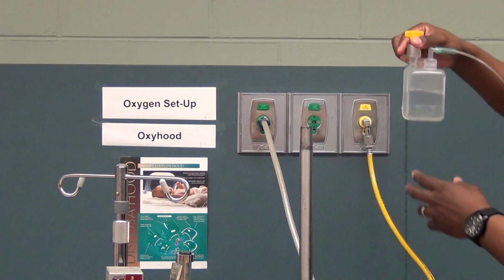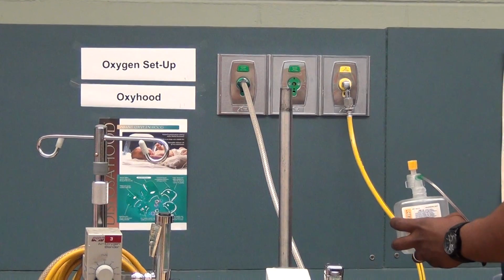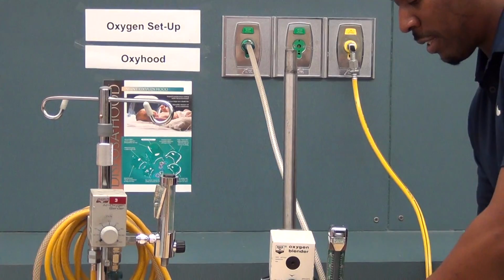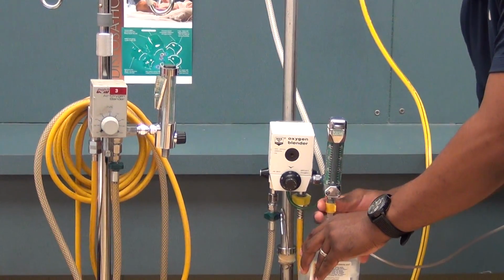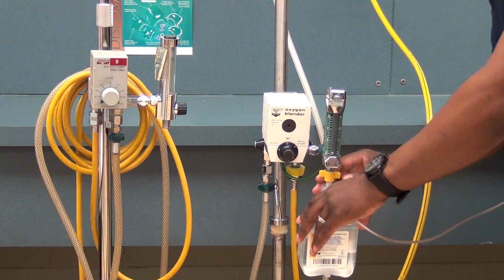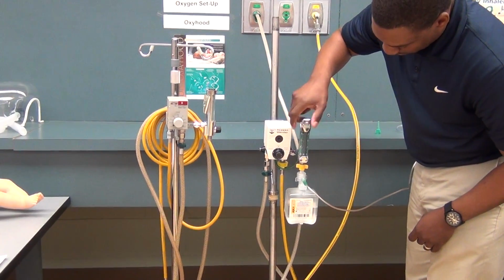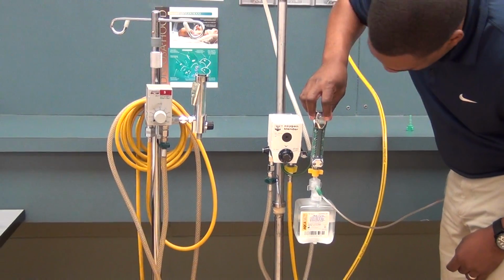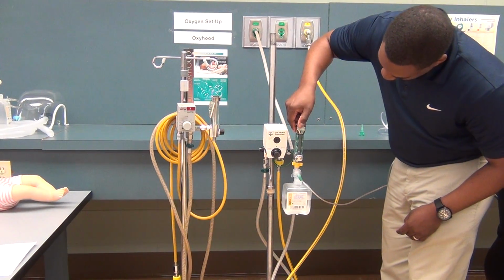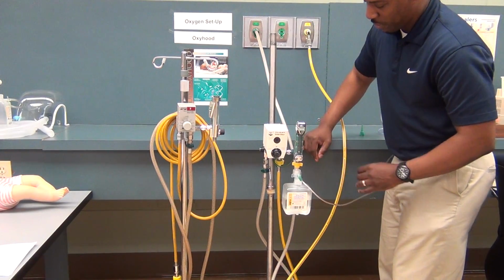In order to use your blender, you can still attach a water bottle if necessary, or your Christmas tree attachment if necessary. And you would just connect it to the flow meter like so. So we will say that our patient is on a 2-liter nasal cannula. We adjust our flow meter appropriately. There we go. So we have our 2-liter flow coming through the flow meter.